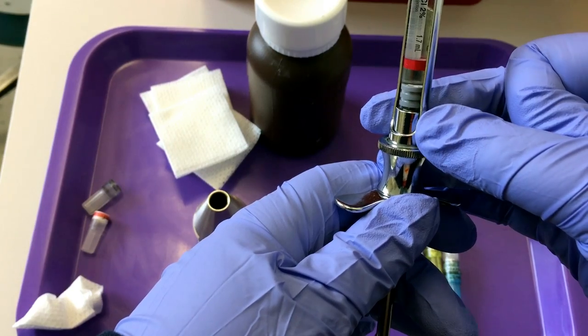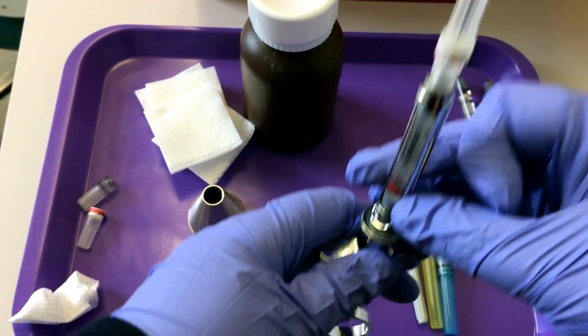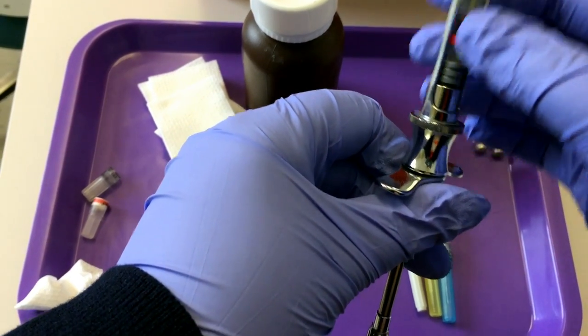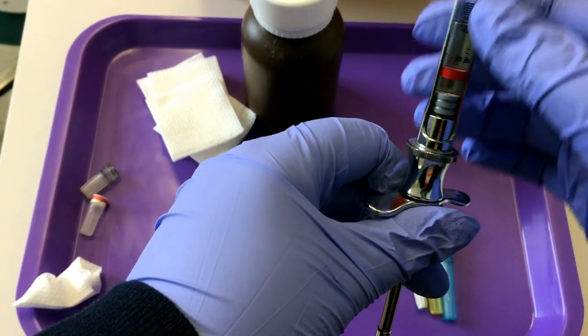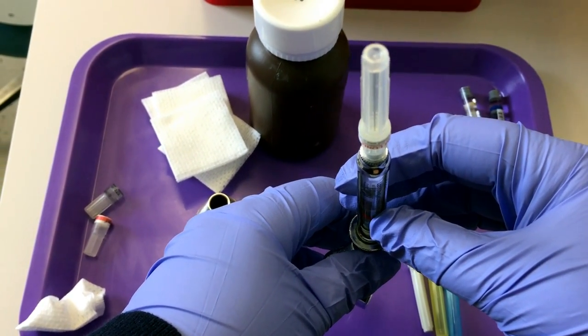Once your harpoon is engaged in the rubber stopper, we want to dispel or dispense any air bubbles that may be in the carpule. We do that by holding the needle vertical.